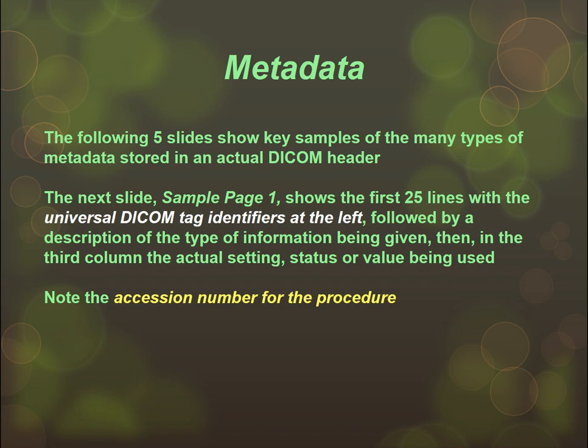So the next 5 slides are going to show you key samples of metadata stored in an actual DICOM header. So notice that to the left, every DICOM data element has a DICOM tag ID. That's what I want you to notice. And also, you're going to see on the first slide that the accession number is one of the DICOM tags.